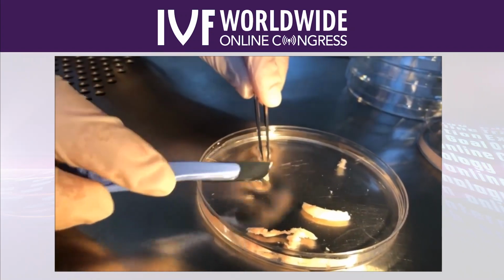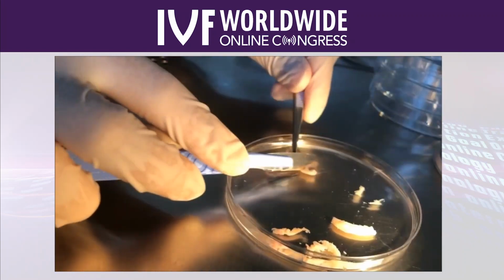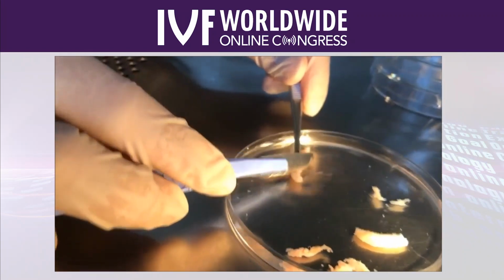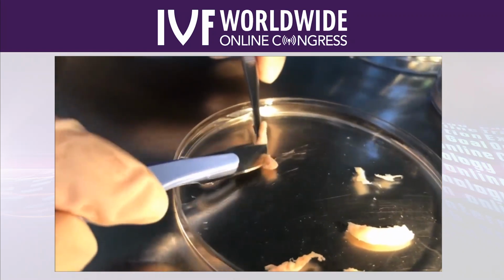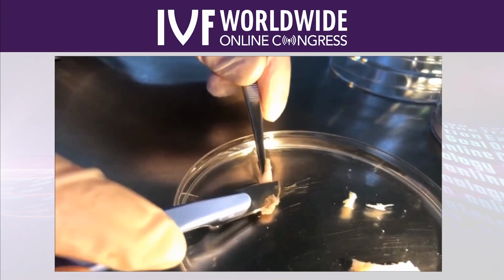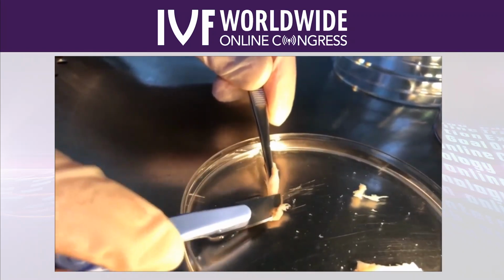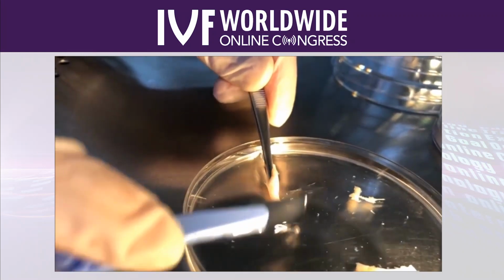And then finally, we are trying to cut away a little more of the medullary part here. So this is here another piece coming off that we will also freeze.